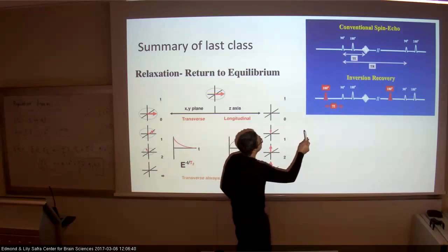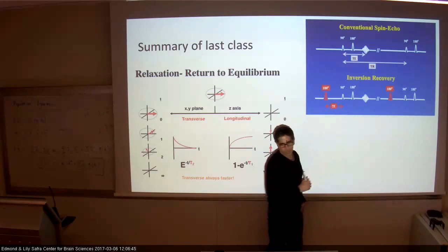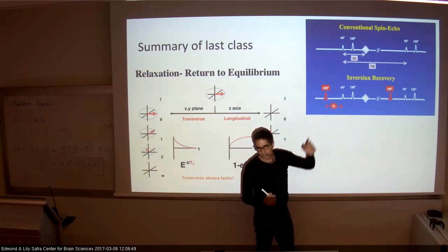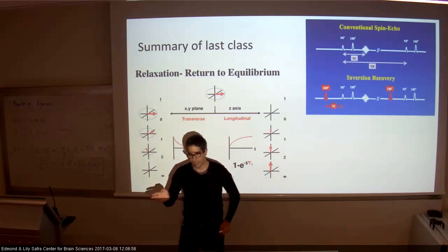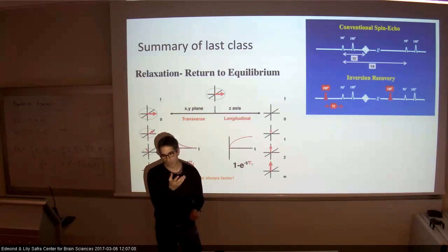So this one, the 180. No, the third one. That was the echo. So you remember there is the spin echo, the one that we have above, the 90 and then 180. That's just creating the echo. So we won't have signal to measure if we won't have this echo. So there is the 90. Thing is dephasing. We're echoing, and there is a moment in time we can measure again a signal.